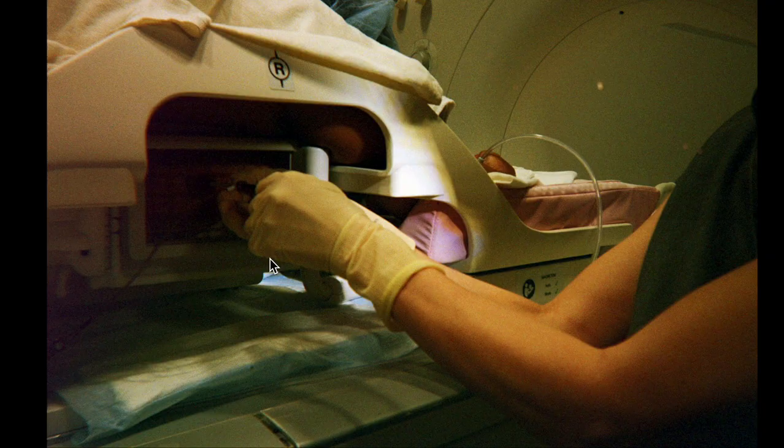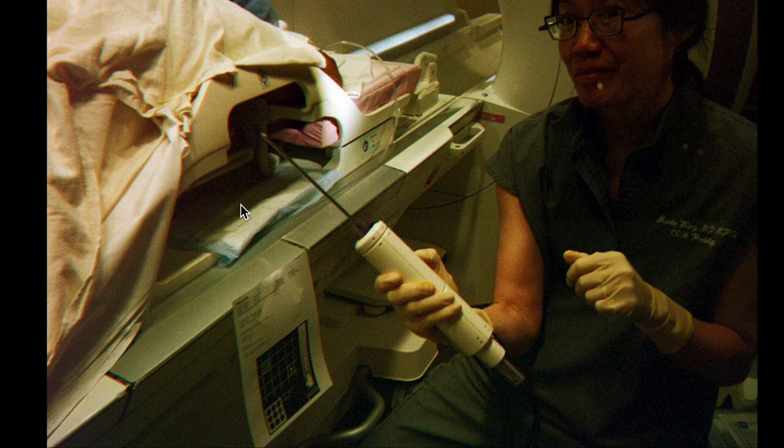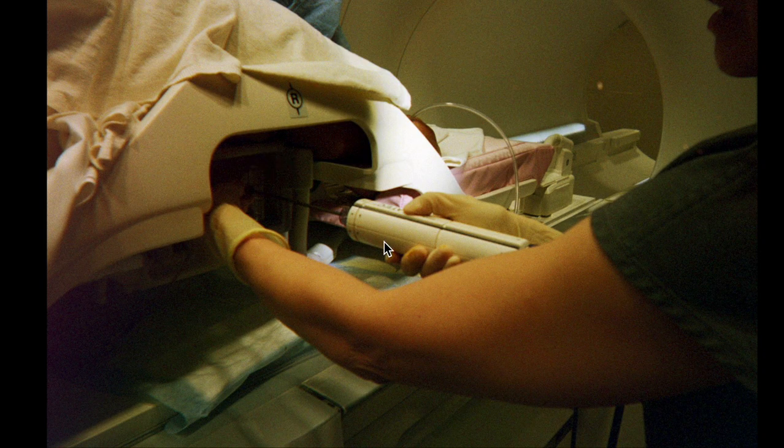Now, if I think I'm in the right place, then I take out the blue space holder. The tech hands me the biopsy device. I put that into the introducer, and there is a flat part of this biopsy gun, and I am holding that flat piece at 12 o'clock.